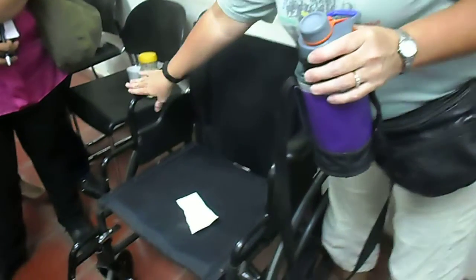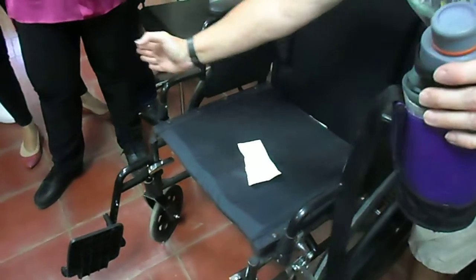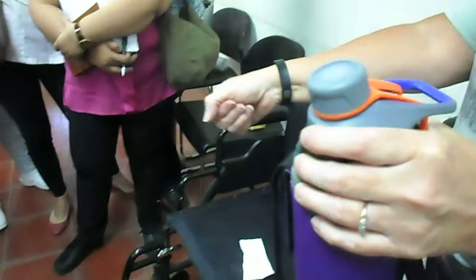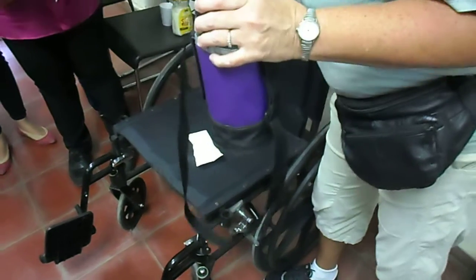We talked about armrests — about desk-length arms and full-length arms. This is a desk-length armchair. It's cut out here, and this would very easily get underneath that tabletop for the lady to do her chores at the table at the house we talked about. These are good for when there's a table. If it were a full-length arm and it still had this mechanism, she could do the same thing by flipping these out of the way.